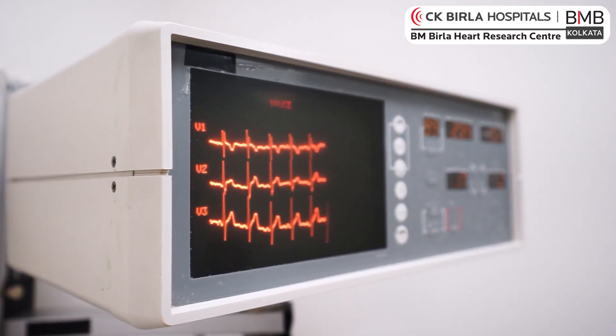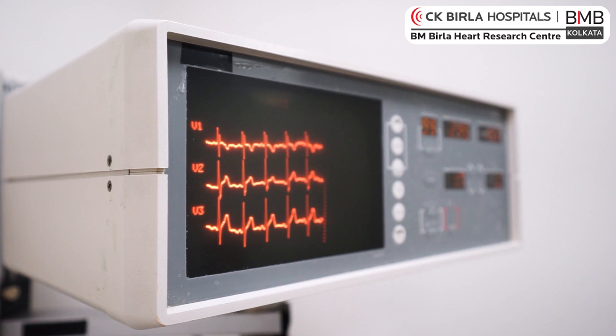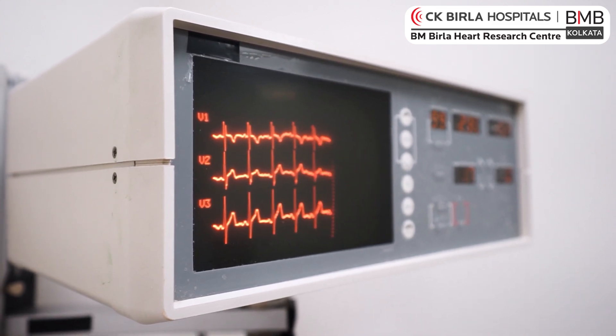This shock-generating capability is not required in routine pacemaker patients, but it is required in some patients who are very prone to developing an arrhythmia called ventricular tachycardia. A pacemaker is a cardiac implantable electronic device which is very novel and evolving, designed to give the best therapy in an electrically abnormal heart.